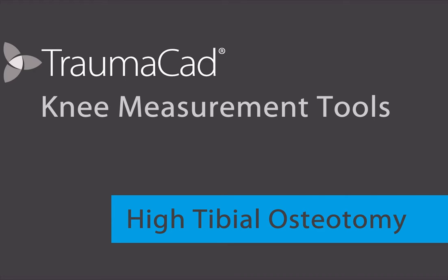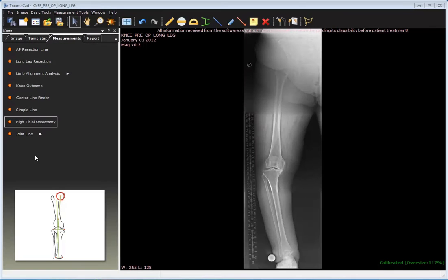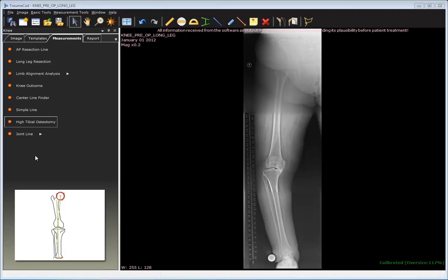High Tibial Osteotomy. The purpose of this tool is to measure the mechanical axis of the femur and tibia and align the total limb mechanical axis so that it goes through the lateral compartment of the knee at a point that is two-thirds from medial and one-third from the lateral, and move the mechanical force from the diseased medial aspect to the healthier lateral aspect.